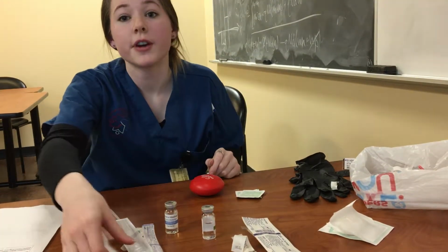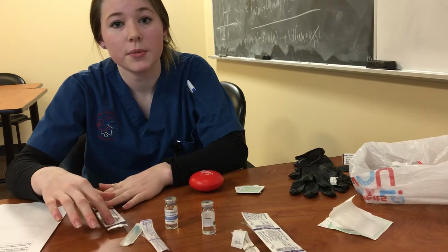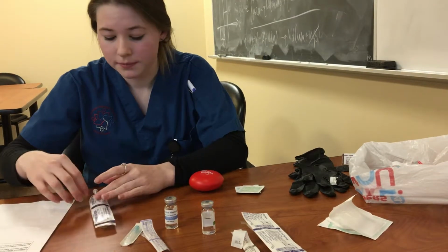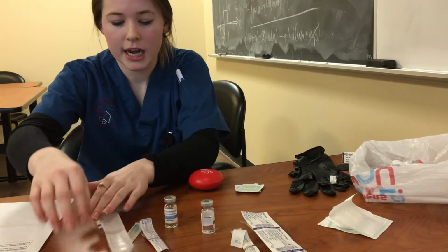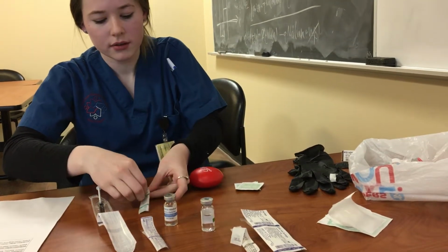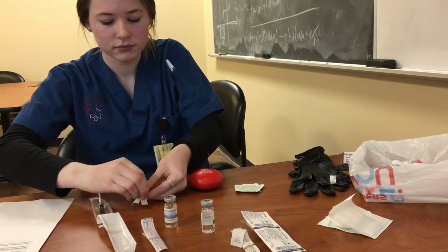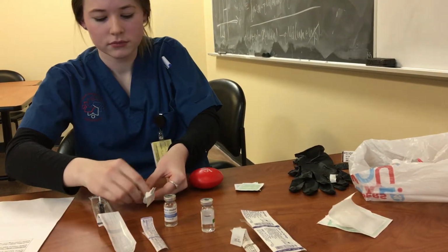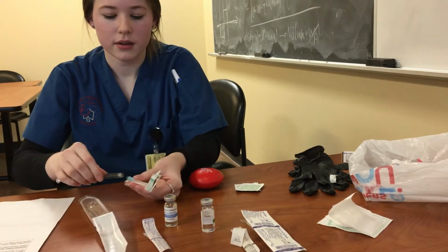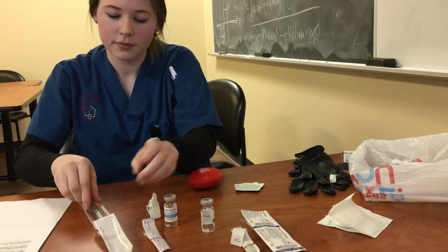So, before I bring the medication to the patient, I want to ensure that I have the name and room number written on the packaging. And I'm just going to add the subcutaneous needle by locking it into the syringe.